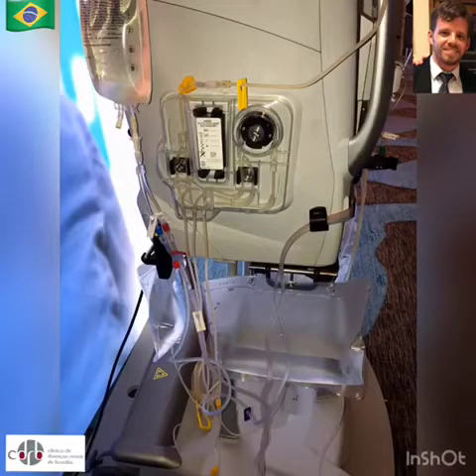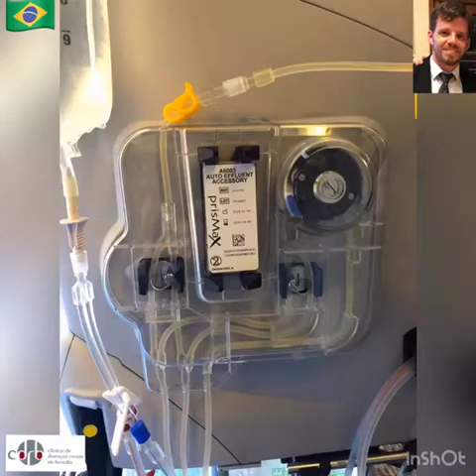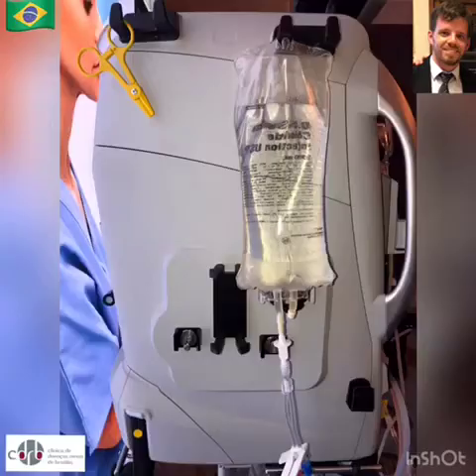Another distinctive feature is the side pump. It directs the effluent to a bag behind the machine and eliminates the need for changing bags, sparing nurse team time. This is an optional device, so you can run your treatment without it, doing it in the old fashion.